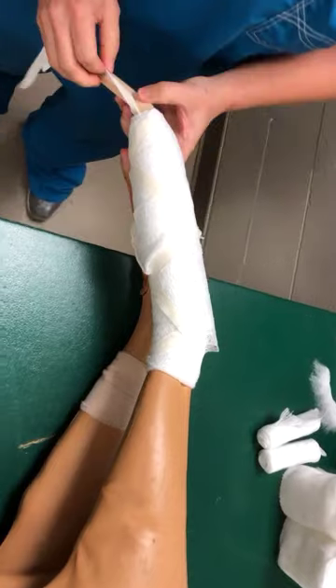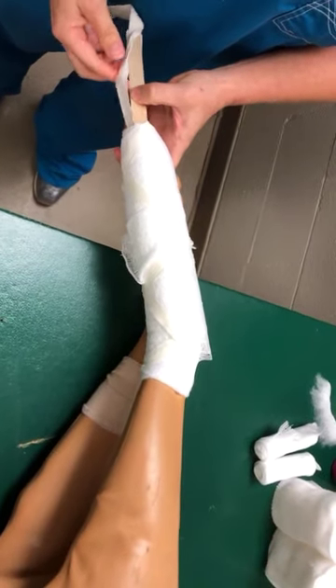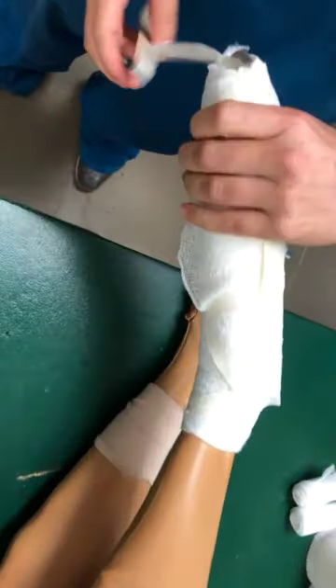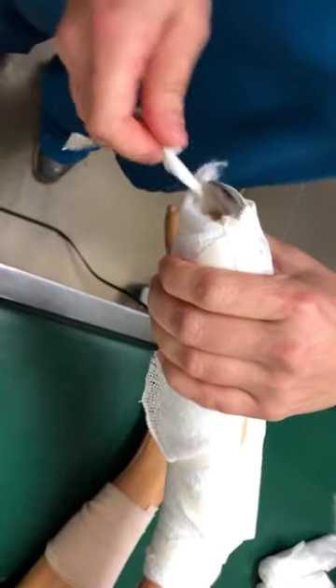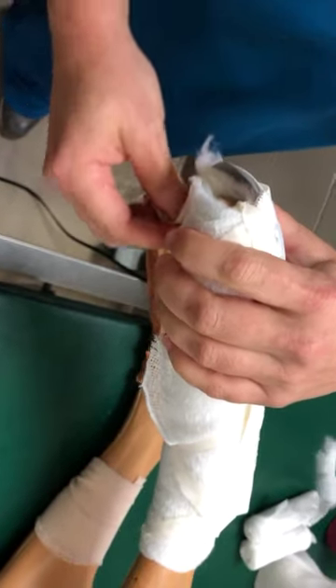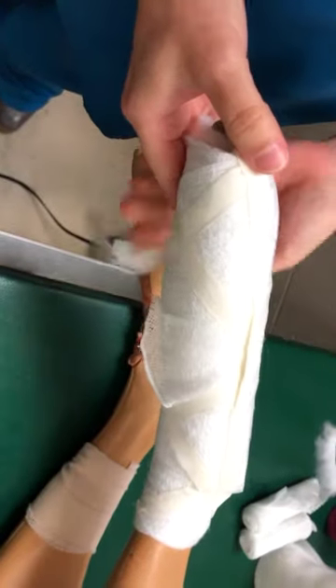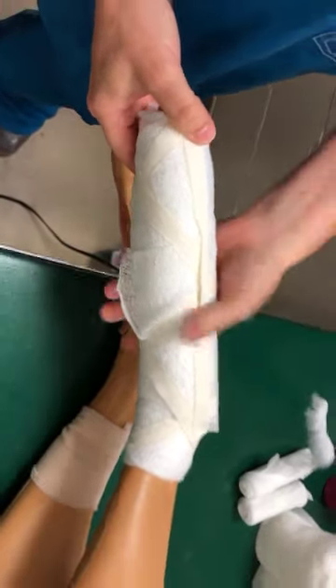I'm going to take my stirrups right before I do my vet wrap. We'll twist them over at the foot and place them up on our bandage. Do the same thing with the other one — don't pull, just fold it over, and that will stick up on the other side of our bandage.